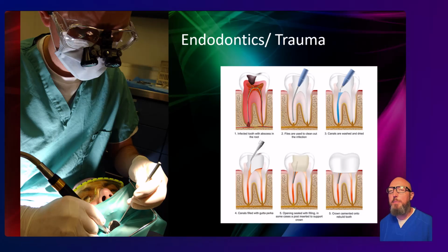All right, next one I want to talk about is endodontics. CBCT is huge for failed treatment, missed canals, vertical root fracture, periapical lesions that don't behave like typical inflammatory lesions, and even complex anatomy like dilacerated roots or anatomical variants. Sometimes these roots have more canals than you might imagine, and you might not be able to detect them with 2D imaging. So the American Association of Endodontists has a position paper joint with the AAOMR, my organization, on when CBCT is appropriate. And they typically say not for an easy case for first-line treatment, but even if it's first-line treatment and you have complex anatomy, they do recommend CBCT.